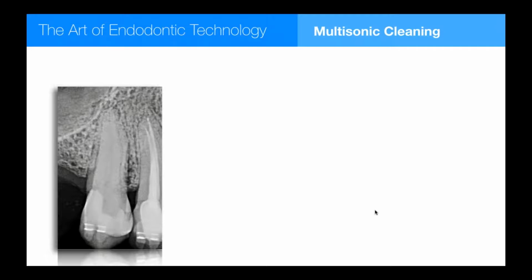I think the proof of this is really in the fill. The proof is in the fill for how effective cleaning was. There's nothing difficult about filling a lateral canal. The difficulty is cleaning it out so you can put some filling material in there. So that's the fun part for me now, looking at post-op obturation radiographs is just a total hoot.